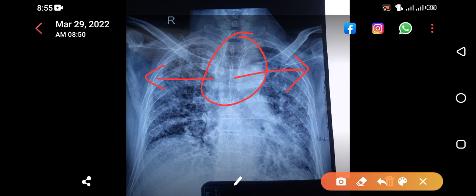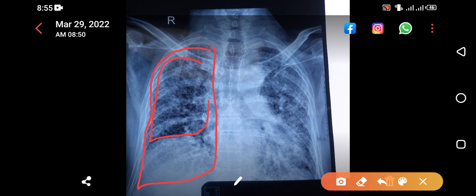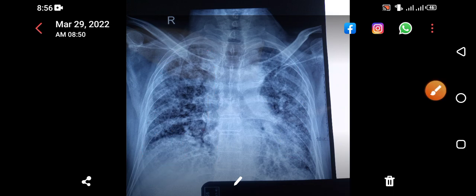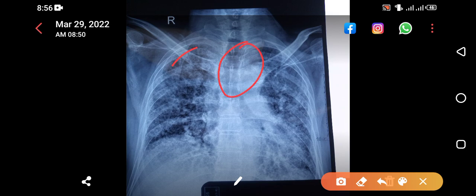You can appreciate the volume loss bilaterally. Ideally the lung was supposed to extend further, but it is reduced — meaning this much volume is lost. So, dilated trachea with bilateral lung volume loss and reticulonodular shadows is pathognomonic for ILD — interstitial lung disease. HRCT confirms the diagnosis of ILD, specifically IPF — idiopathic pulmonary fibrosis — or UIP, which is actually a histological diagnosis.